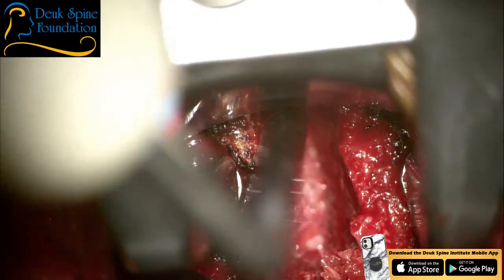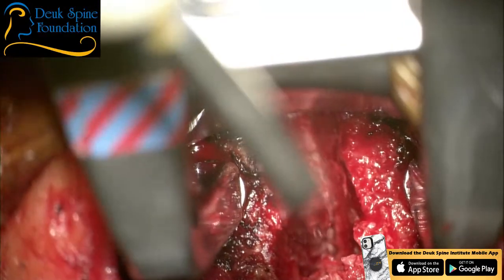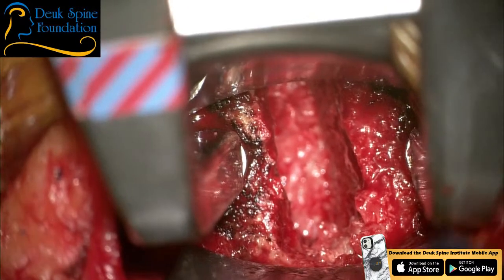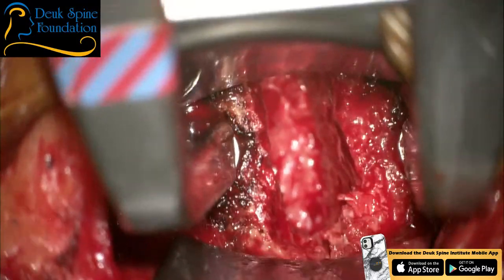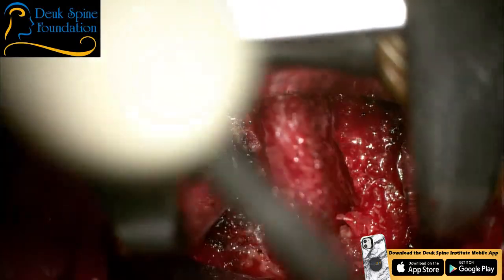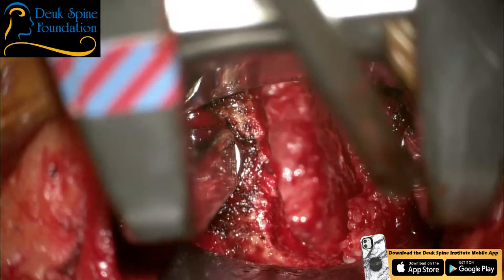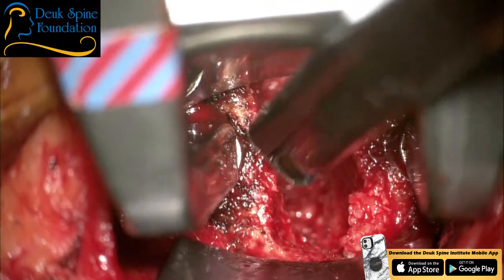Great. I need the drill. Actually, let me have a bigger Kerrison first. Yes, so I'm working out the right foramen at C6-7, and I need a bigger Kerrison. Yes, and there's a lot of, careful, there's a lot of bony material, like calcified disc material here, and osteophyte. So, gentle now.